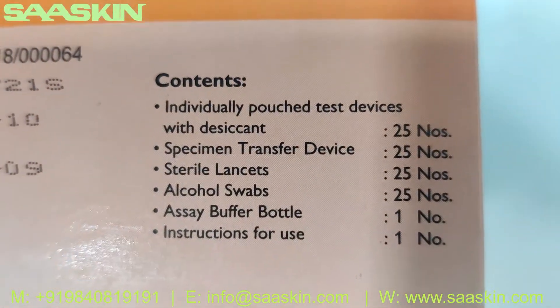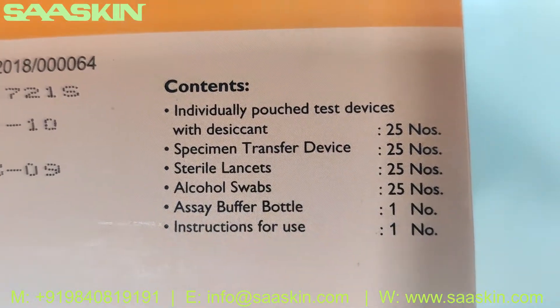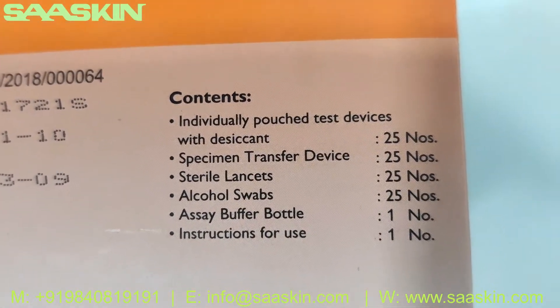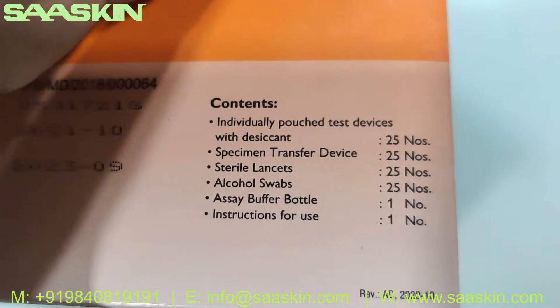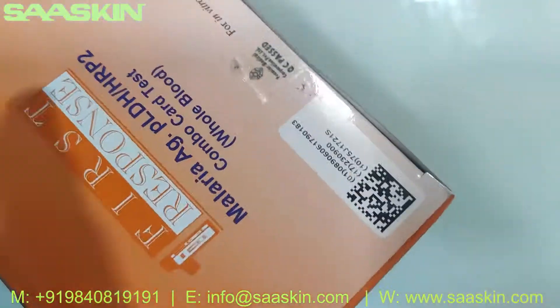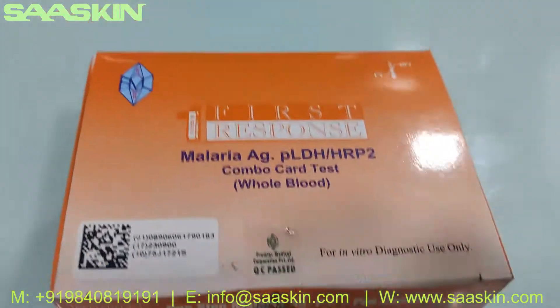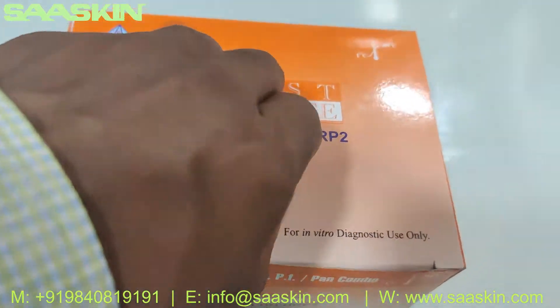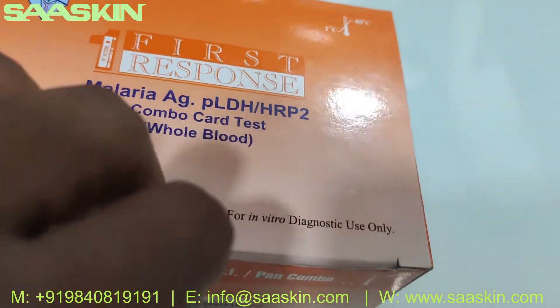The kit contains individual pouch test devices with desiccant — 25 numbers — and you get 25 specimen transfer devices, 25 sterile lancets, 25 alcohol swabs, one buffer bottle, and an instruction for use. This is how the whole box looks — it's a WHO pre-qualified kit for the Malaria Antigen Pf Pan Combo Test.